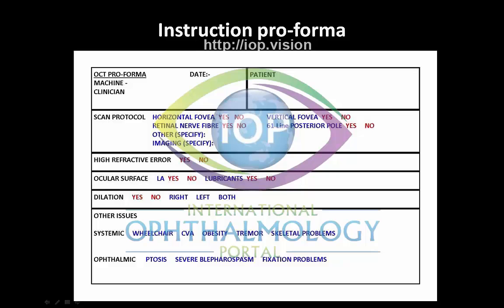We then have the option of retinal nerve fiber layer acquisition or full retinal thickness 61-line posterior pole acquisition, and we usually do both on most patients. We also have the option of requesting other types of imaging depending on what we're trying to look for.